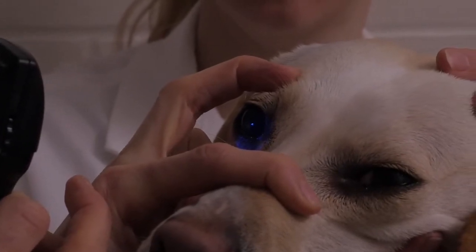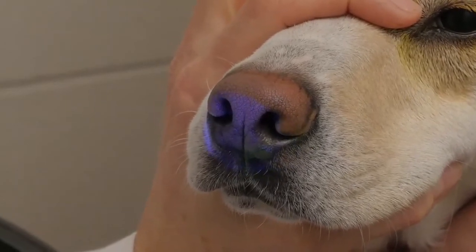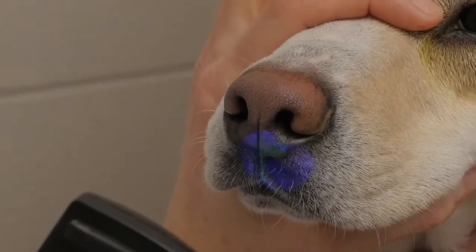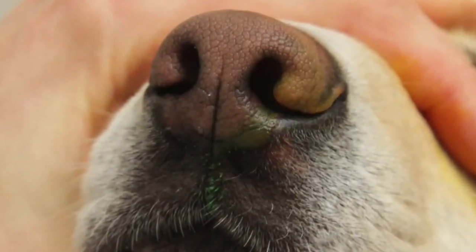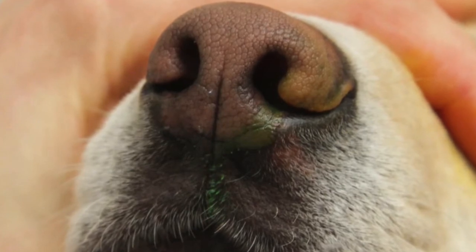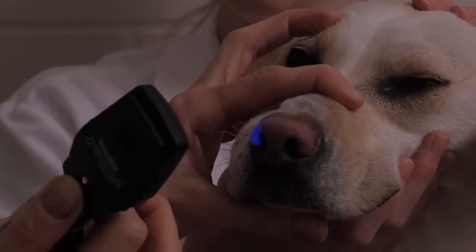To evaluate nasolacrimal patency, the nares and pharynx can also be examined with the cobalt blue or ultraviolet light. With a patent nasolacrimal system, dye will be present in the ipsilateral nostril within 5 to 10 minutes in small animals and up to 20 minutes in large animals. This test for patency is also known as a Jones test. The absence of dye passage, however, does not necessarily mean nasolacrimal duct obstruction.